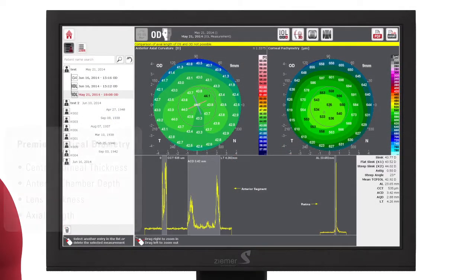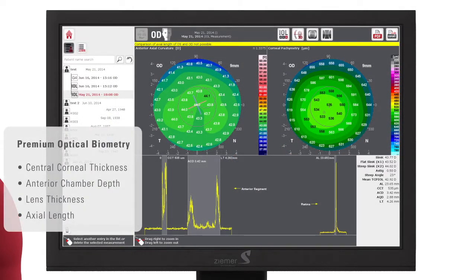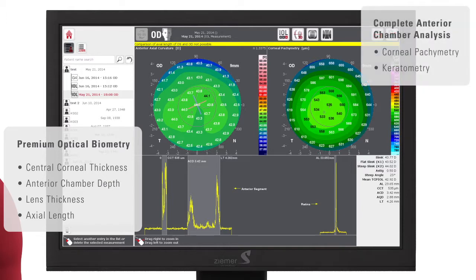The biometry curve is shown at the bottom of the biometry report. Central corneal thickness, anterior chamber depth, lens thickness, and axial length are displayed. On the upper half of the display, an anterior axial curvature map and corneal pachymetry map are shown to analyze anterior chamber parameters.